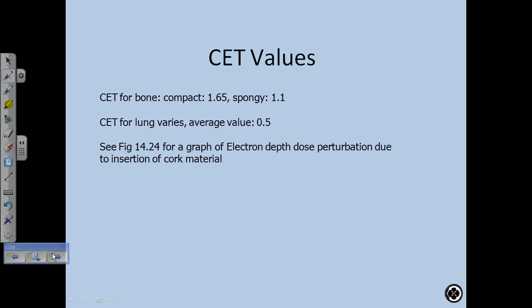Okay. So this just shows how it stretches out. I don't know if you can see this, but I'll draw it here. So a typical water depth distribution. They've got 18 MeV electrons, so this is the PDD for 18 MeV electrons. This curve looks a little funny because there's no branch drawn in here. This is how they're drawing it.